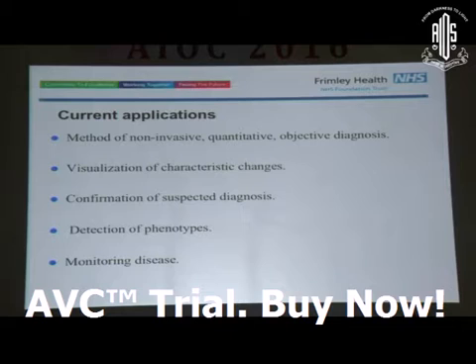So what are the current applications for autofluorescence? The method, of course, is non-invasive. It gives you a quantitative figure, and it is an objective diagnosis. It allows visualization of characteristic changes. It can confirm some of your suspected diagnosis. It helps the detection of phenotypes and also helps in the monitoring of disease.